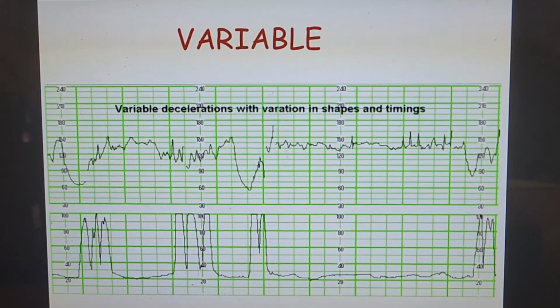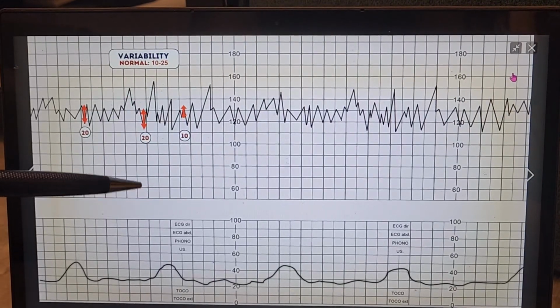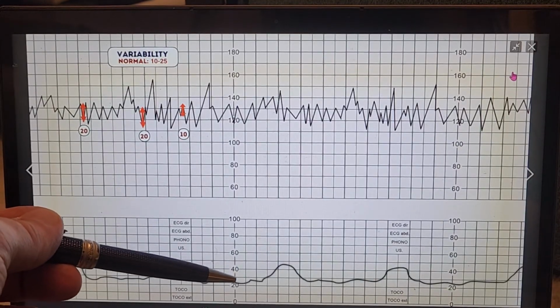Regarding the uterine part, we know that for the uterine contractility there is a unit called the Montevideo unit. It's a unit used to calculate the uterine contractility. It's probably too advanced for you, but you have to know it, maybe in case anybody asks you from the external examiners. And the Montevideo unit is the number of millimeters.